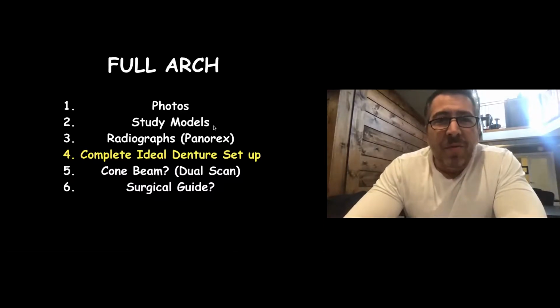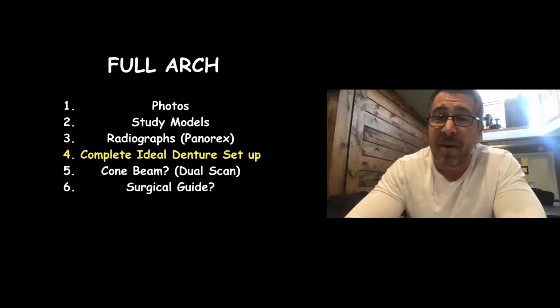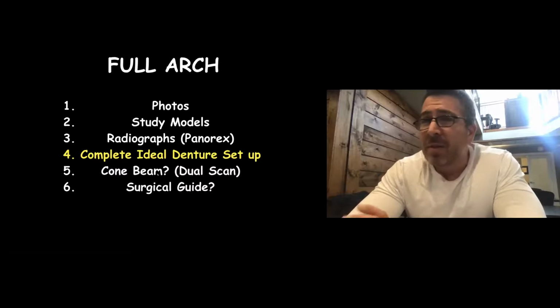So for full arch cases, things are no different. Photo study models, Panorex, complete denture setup, because again, we're working from the final result backwards. Figure out what the patient wants to see. You got to show them what the teeth are going to look like before you start. Cone beam, yes or no, and decide surgical guide, yes or no.